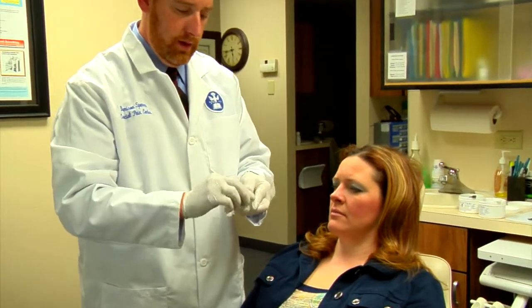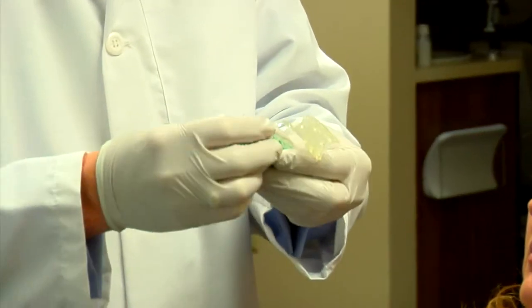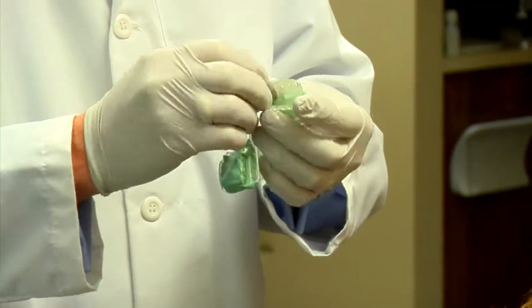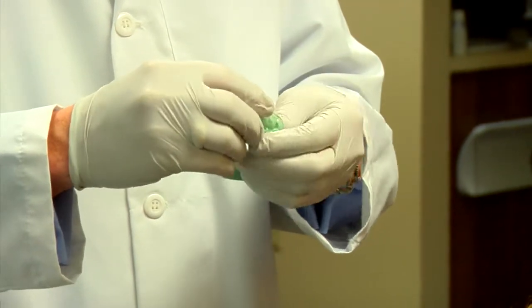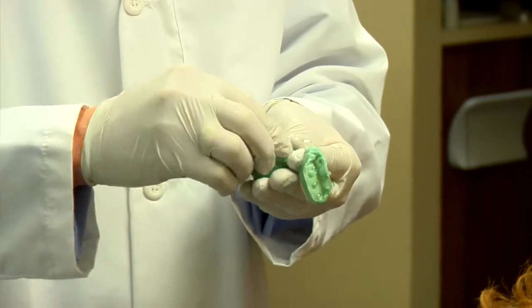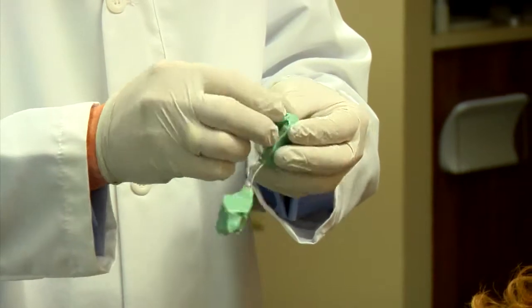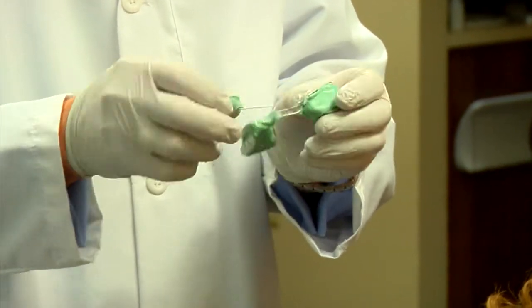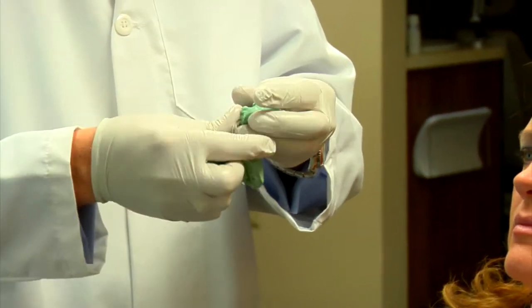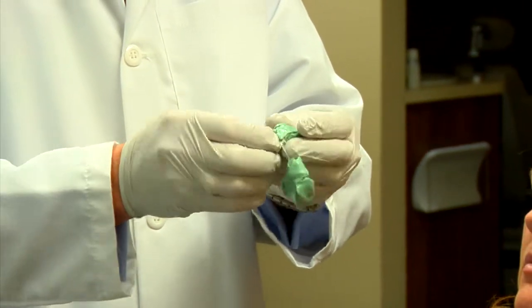I'm just going to put that into the tray, on the top. There are little holes in the tray that are going to allow this material to go through from one side to the other. This locks in the material to keep it from coming out. We also put a little bit in on the tongue side to make it smooth and comfortable, and on the cheek side to do the same thing on that side, and also to make sure that the material is locked in 360 degrees.